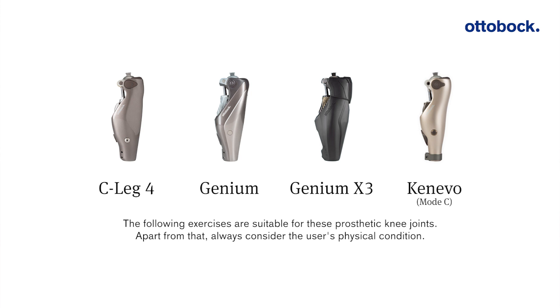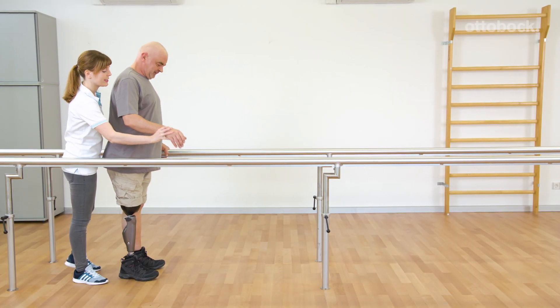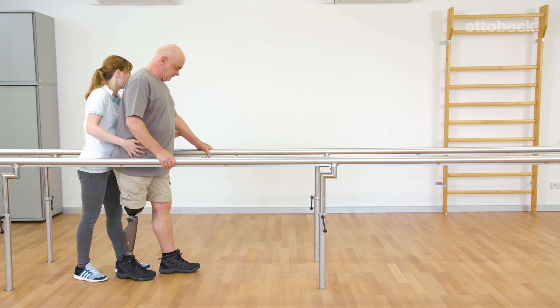The following exercises are suitable for these prosthetic knee joints. Apart from that, always consider the user's physical condition. Franziska and Gerhard show how to reduce the use of walking aids until Gerhard is able to walk unassisted.